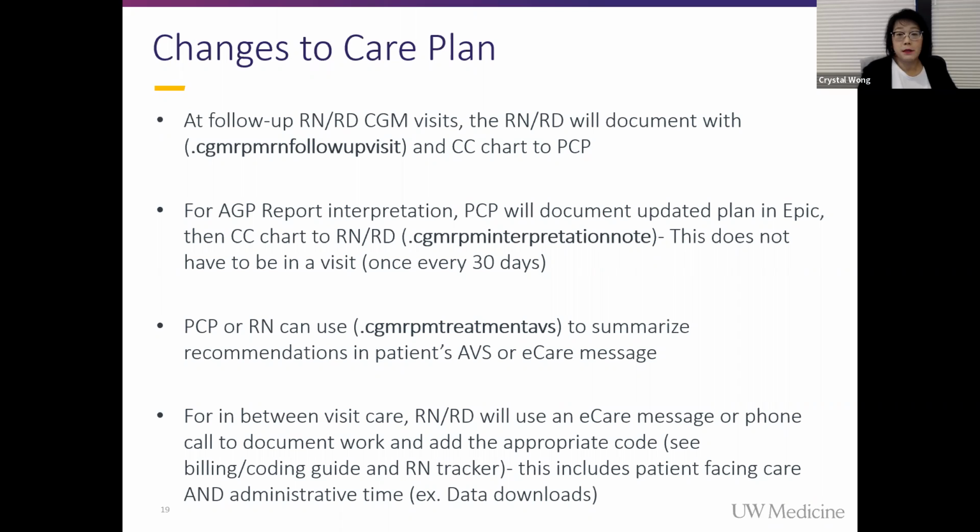All of that time is actually billable. It doesn't have to be face-to-face with the patient. So if your RD takes 30 minutes to log into LibreView, download the report, put it into Epic, analyze it, input the data, and then send it to you, they get to bill out that amount of time. And this is where hopefully we're pushing medical care in the future, which is actually getting compensation for the hard work that not just the provider does.